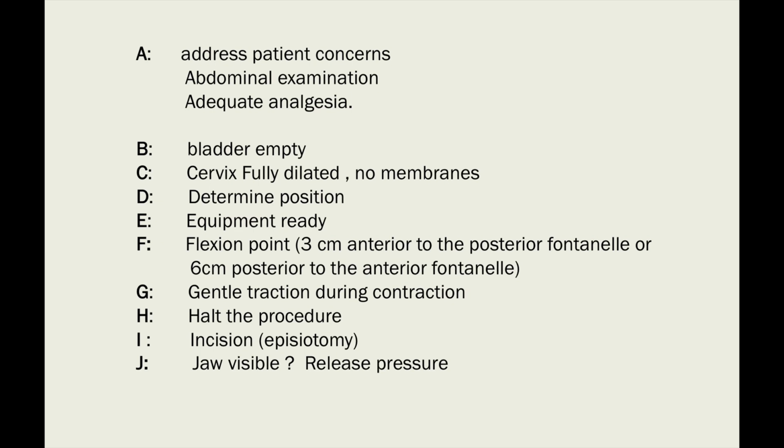So we can apply the cup in between the contractions and be ready and ask the lady to tell us when she feels a contraction. Or if she's under epidural, I will ask the midwife to have a feel on the tummy and tell me when there is a contraction. Then I will start to pull, because it's like a combined effect from the pull from down below and the push from the mother herself. Okay, so that's the gentle traction.